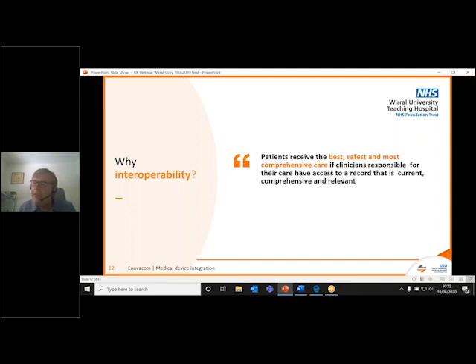Mark mentioned the number of medical staff who are either shielding or isolating away from the workforce. Over the past 12 weeks, we regularly have 2,000 to 3,000 members of staff, not all clinicians, accessing the system remotely. They can write notes, they can review patients, and certainly consultants on call will use VPN to look at the total patient records, including the latest vital signs and ventilator settings.